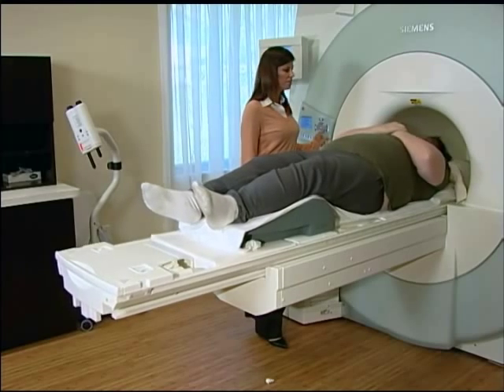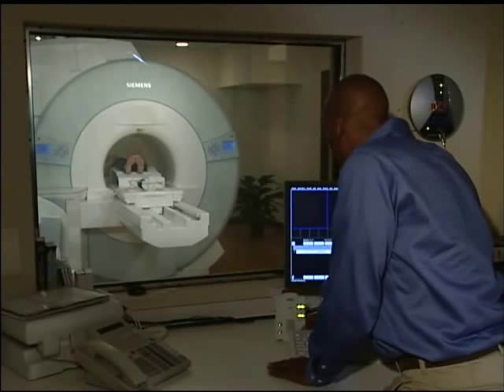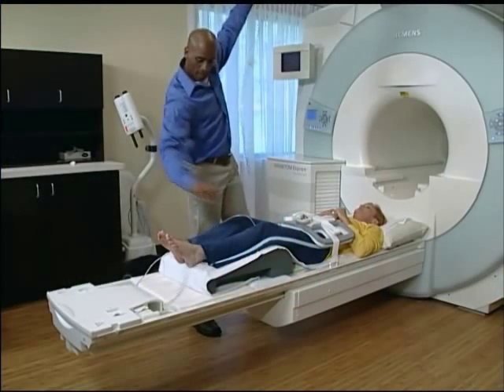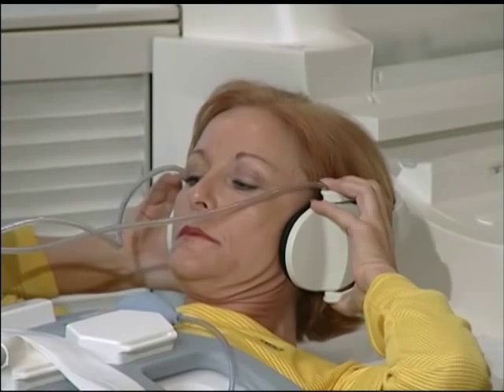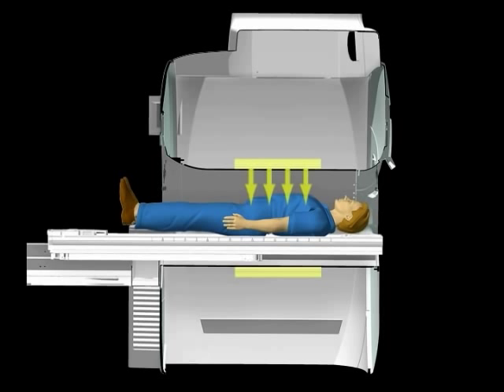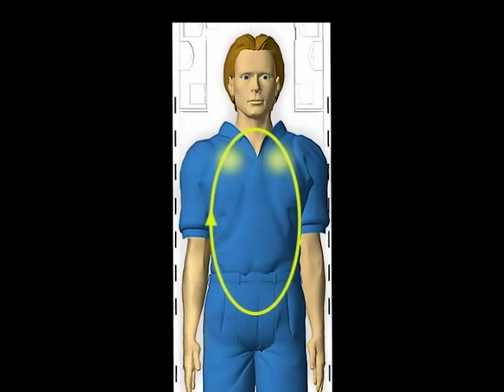Since the coils generating the gradient field are located in the static magnetic field, a sudden force is exerted on them when the current is switched on or off. The noise increases with the strength of the static magnetic field and the gradient fields. Siemens MR scanners are equipped with audio comfort features which reduce the noise levels typical of other scanners. However, it's always good practice to wear hearing protection. In rare cases, quickly switching on and off the magnetic gradient fields can induce electrical voltages in the peripheral nerves, expressed as a tingling sensation or mild muscular twitching.